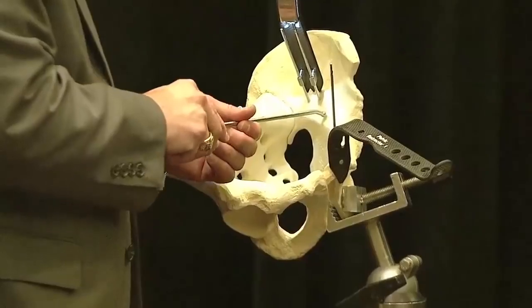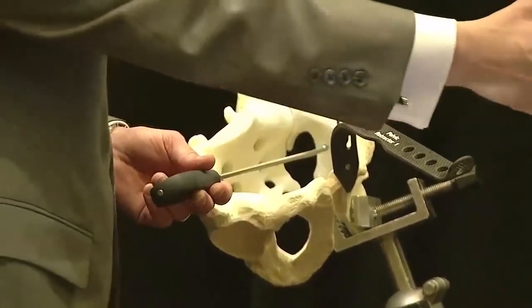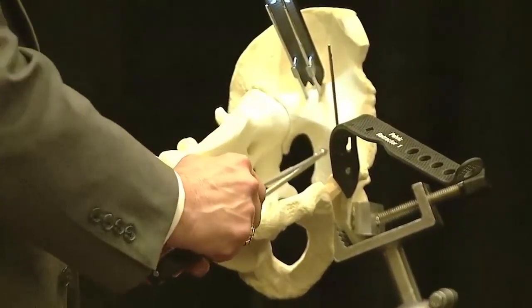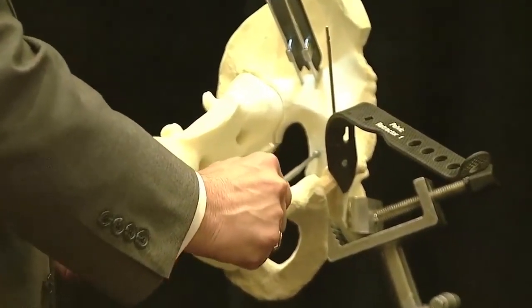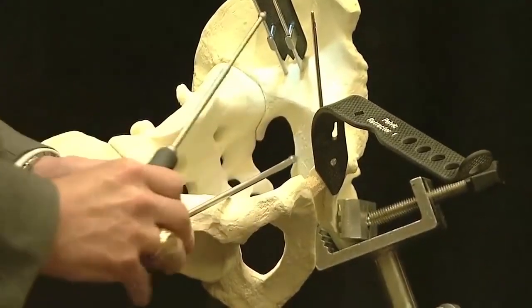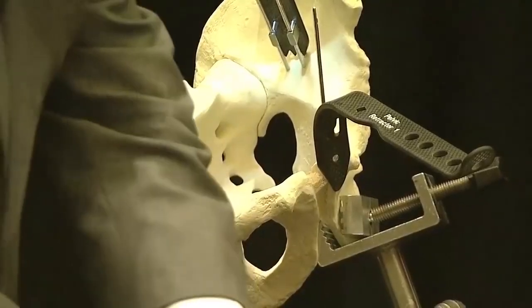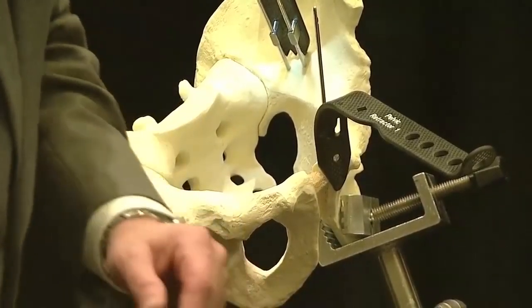But these are very nice because of the angle. They allow us to push it in here without sliding on the bone. This is the traditional straight ball spike pusher. And you can imagine it coming in at this angle, trying to lift the bone up, it'll skive or slide off. And the new ones allow us to manipulate the bone fragments more easily because they're angled and designed. They're long enough to fit in the wound.